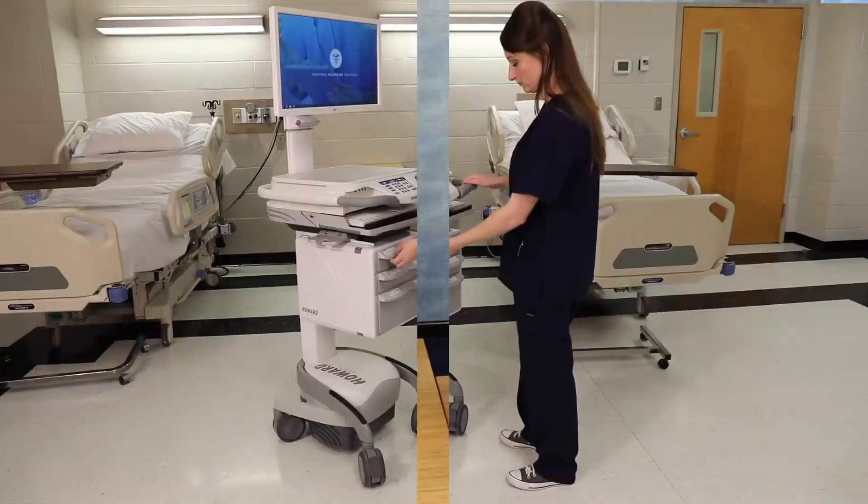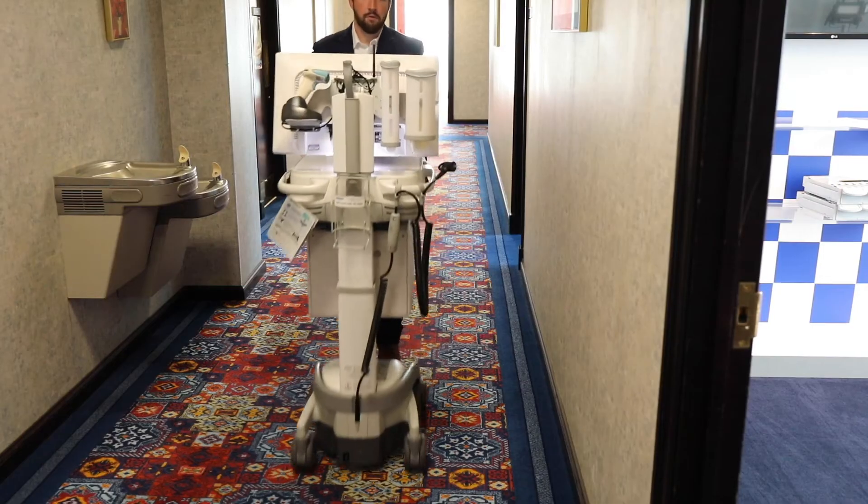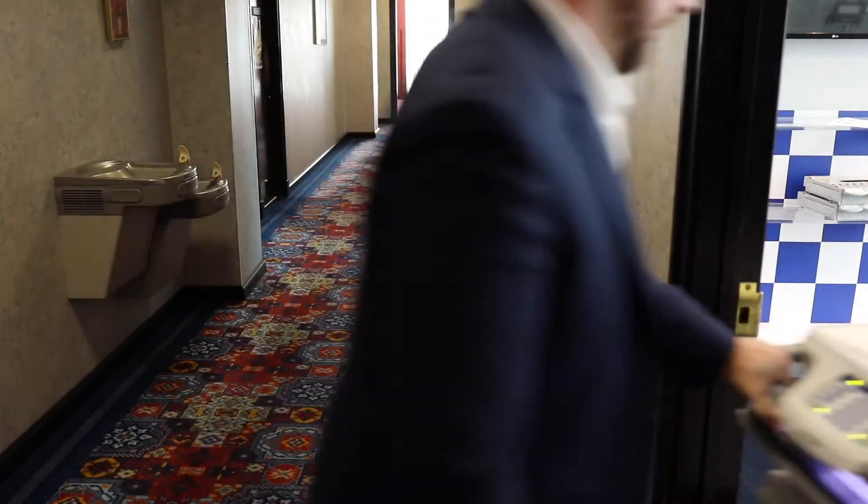Welcome to Howard Medical's High Care E and High Paradigm E series of carts. In this video, we will demonstrate the features, functions, and operation of our point-of-care carts.